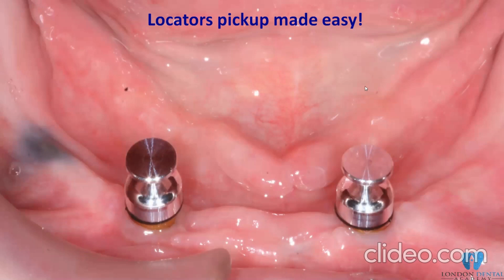We have two or three now in the market, but most of them come from Zest Anchor, an American company, which basically makes the same replica, or the same shape, for all implant systems. I have never come across an implant system that doesn't have a locator, but now some other companies like Nobel Biocare have started producing their own locators, and also Straumann, I think they call it Novaloc locators.